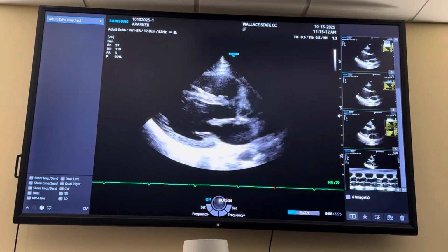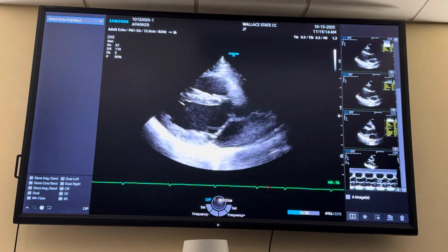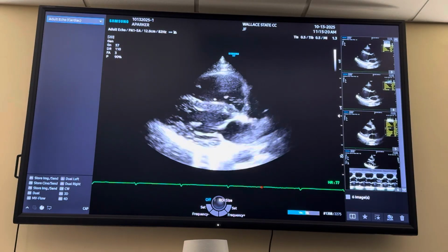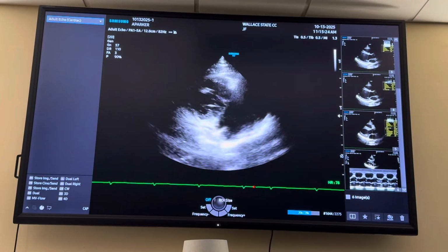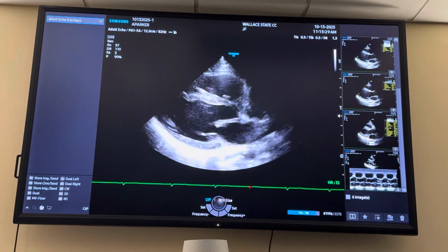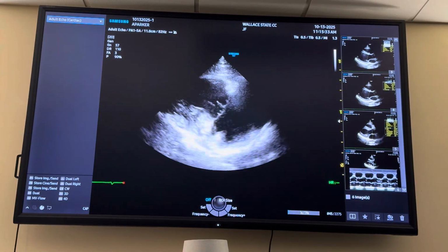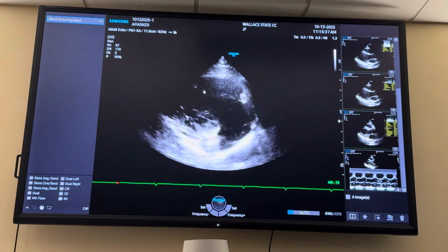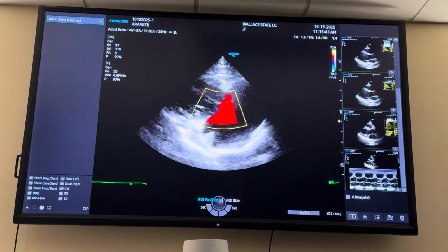So I'm gonna come back to my parasternal. So I'm gonna angle the probe down. So I'm gonna send the sound waves back down. I always think as if I'm angling back towards her hip, her right hip. So the cord's actually gonna come towards her left shoulder. So I'm just angling down. So from parasternal, I'm gonna slowly angle down. And this is the RVIT. So right atrium, tricuspid valve, right ventricle. You're gonna take a clip store here, then you're gonna show color.